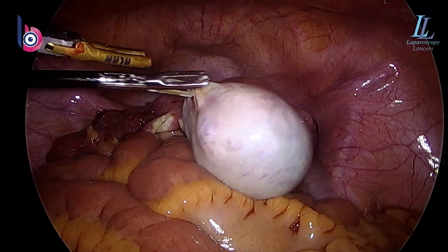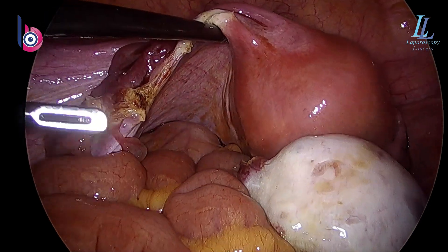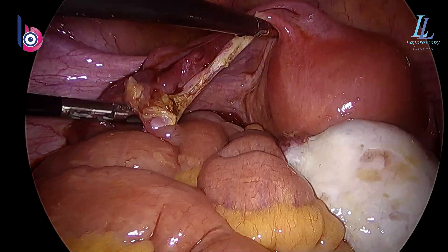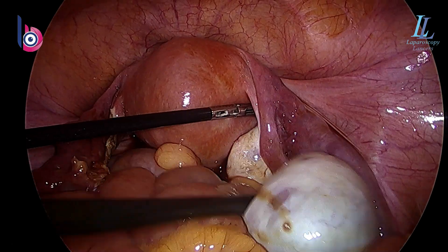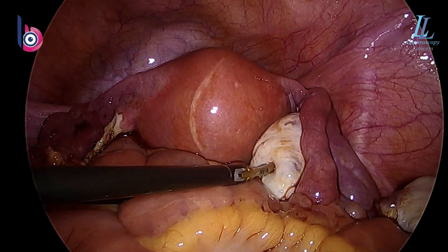We'll be using an improvised endo bag. The hemostasis is adequate — that's all which is required. Inspecting the right ovary — that's perfectly normal.